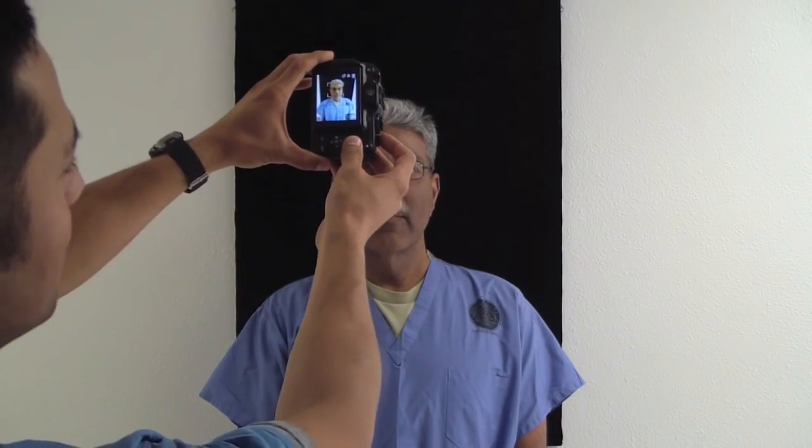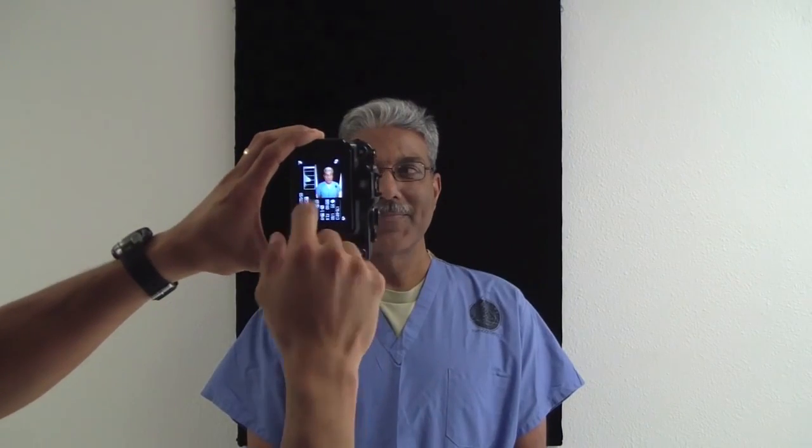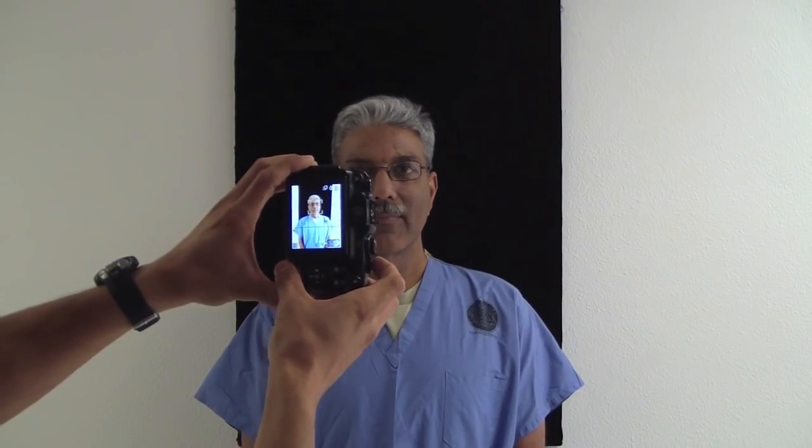In this position, we get the patient to stand in front of whatever wall or inanimate structure you'd like. And Dr. Insani was talking about where to get the patient to look, whether it be at the horizon or pretend there's an image. You can also direct them to move their head in any way you want. So the first image you're going to get is a plain neutral face, and I know now after a couple photos I need to angle my camera at a different angle to prevent any glare off his glasses.